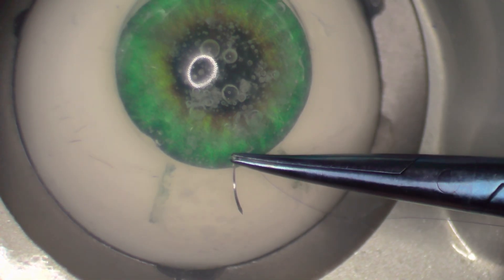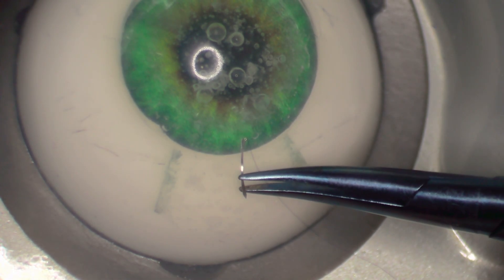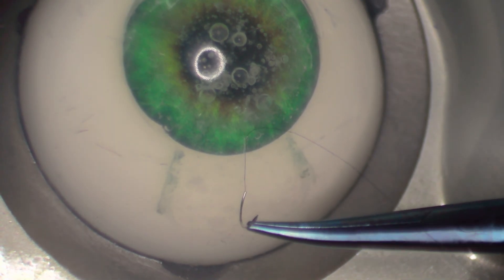Do not use any force other than rotating the needle around its axis. Otherwise, you might bend the needle or put too much pressure on the tissue. Step five: grab the needle behind the tip. Just in case you need it again, you don't want the tip to get blunt.